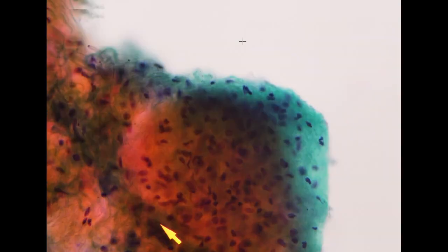Along with these collagen fibers, you can identify some very tight clusters of atypical glandular cells over here. This is representative of the stromal invasion we see in tissue specimens along with desmoplastic stroma.